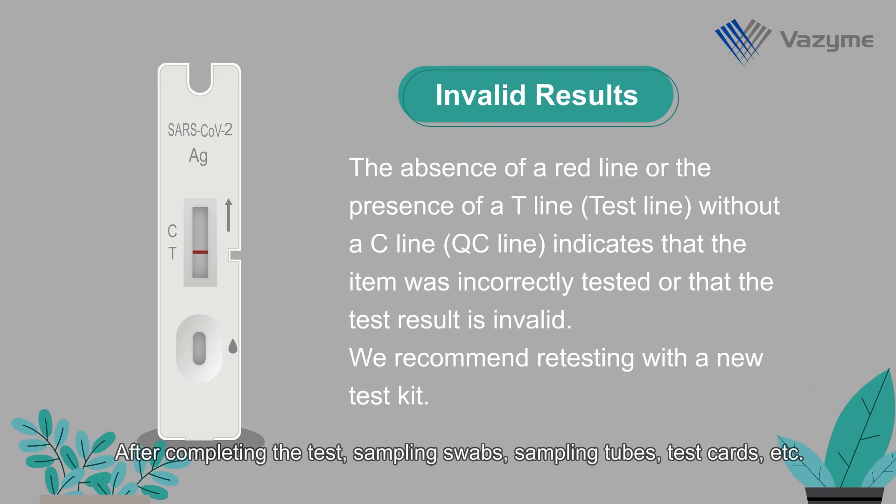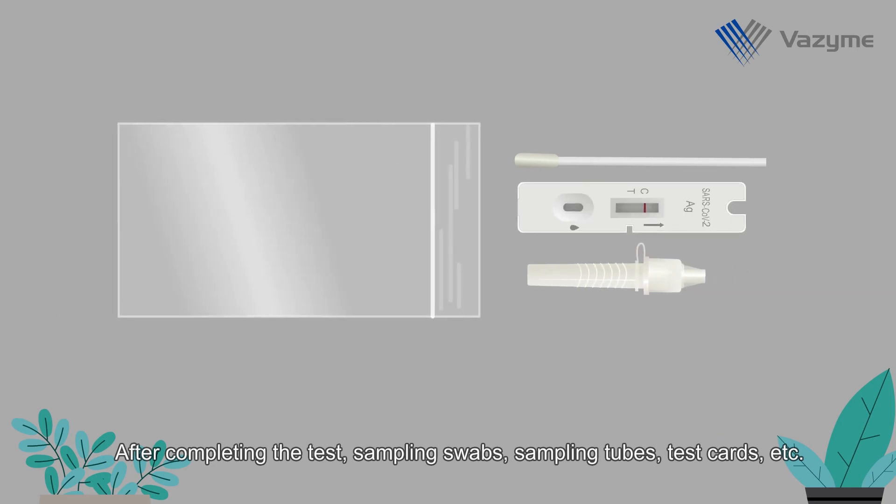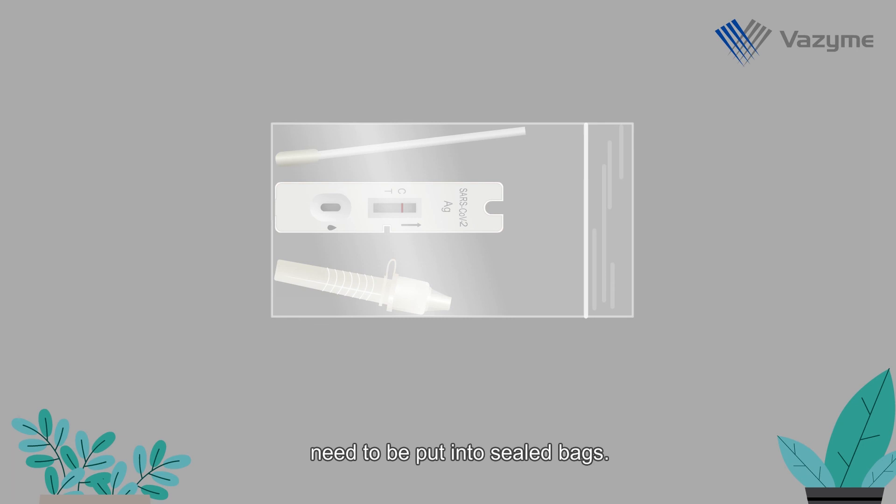After completing the test, sampling swabs, sampling tubes, test cards, etc. need to be put into sealed bags. Disposal of waste needs to comply with the relevant local regulations.